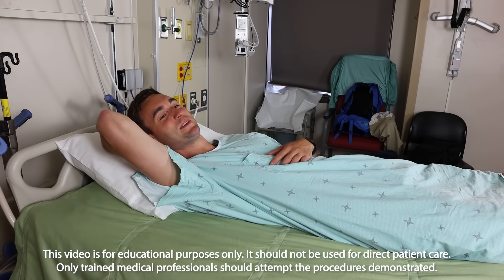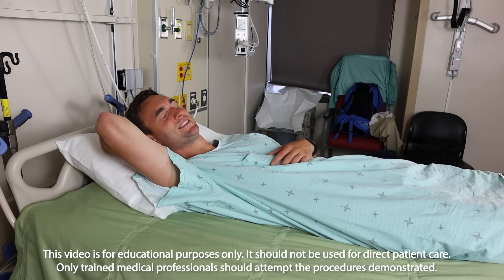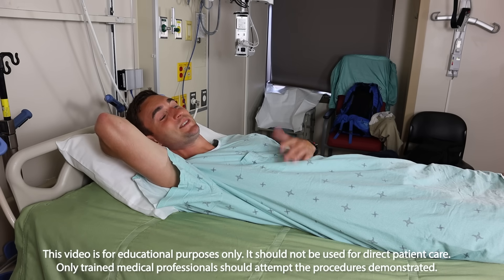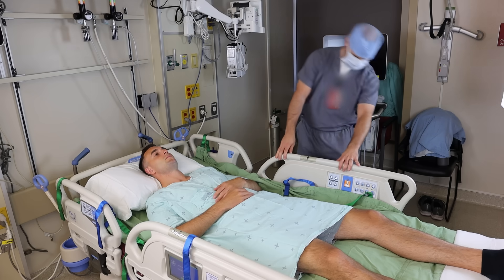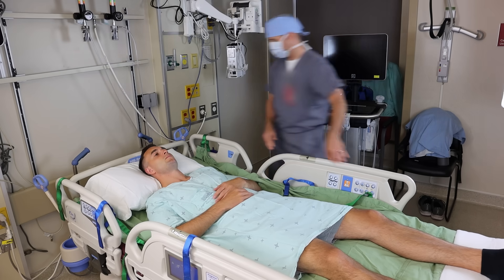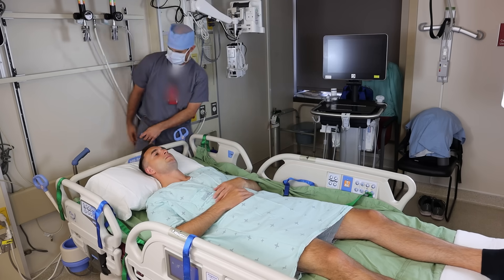Today, Dr. Frankel will be the model for the right internal jugular central line. It's probably the one you're most likely to do, but stick around because we do discuss the other common sites. A smooth central line is all about preparation, and Dr. Parsons is helping me out by attending to patient positioning.